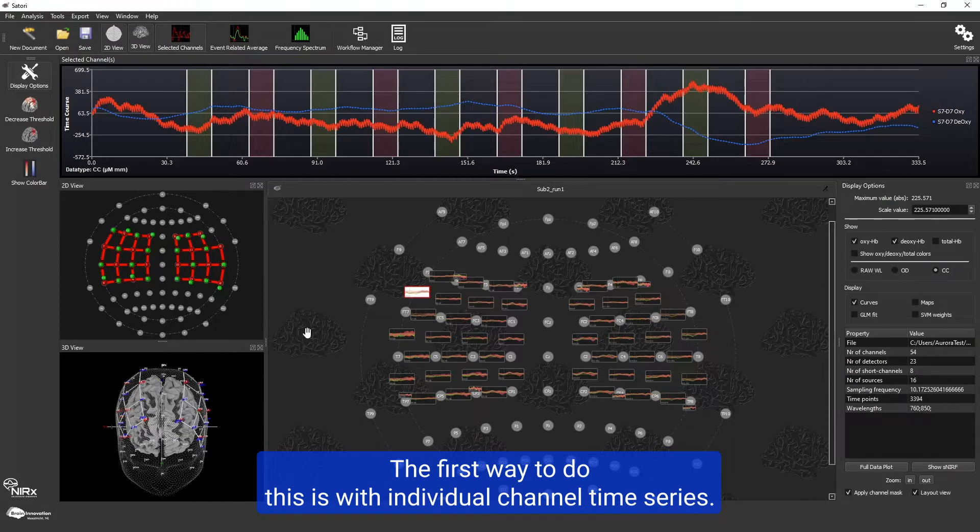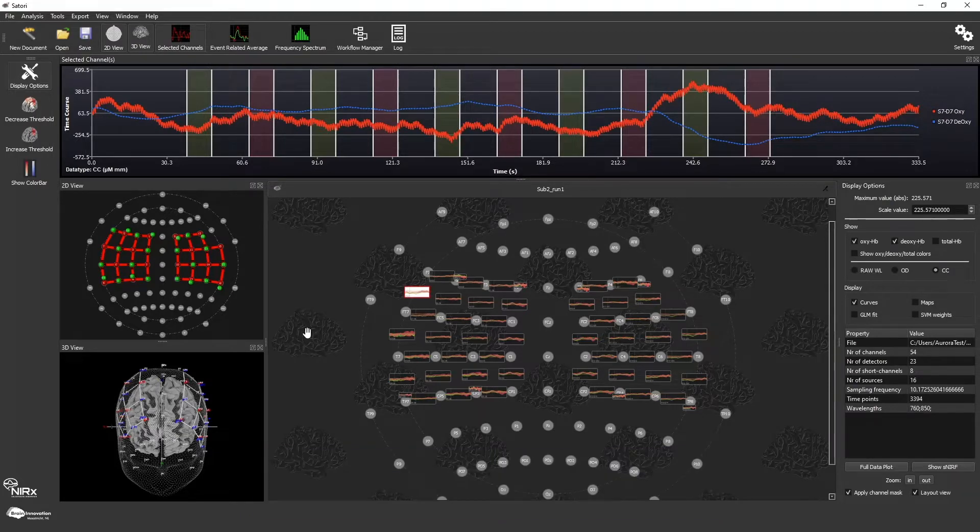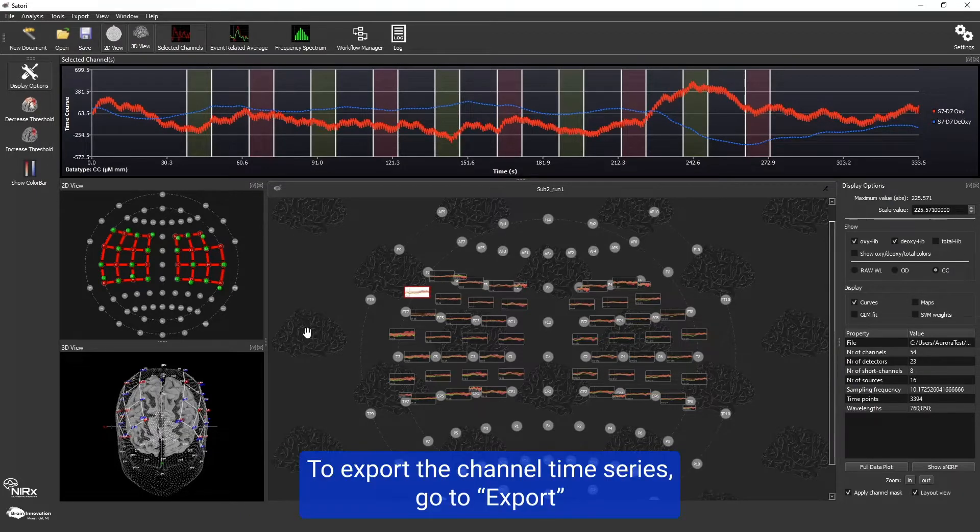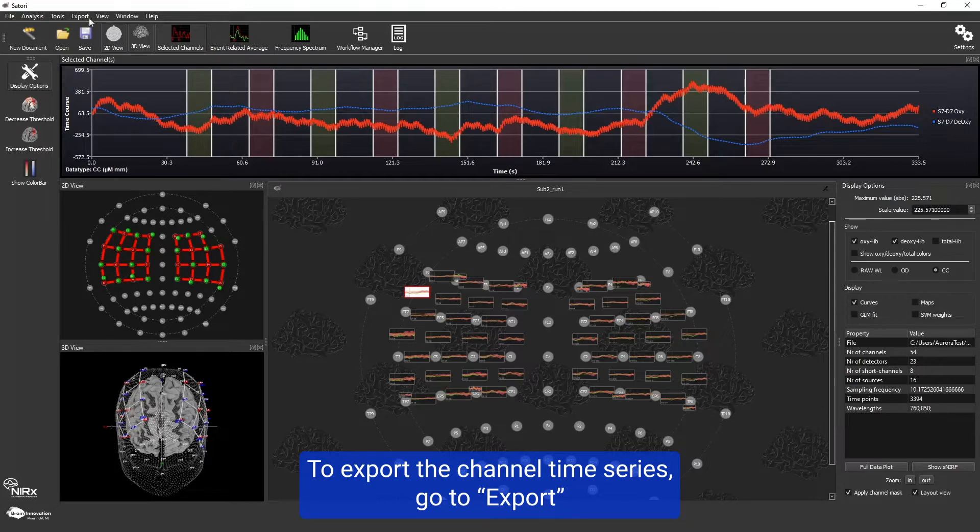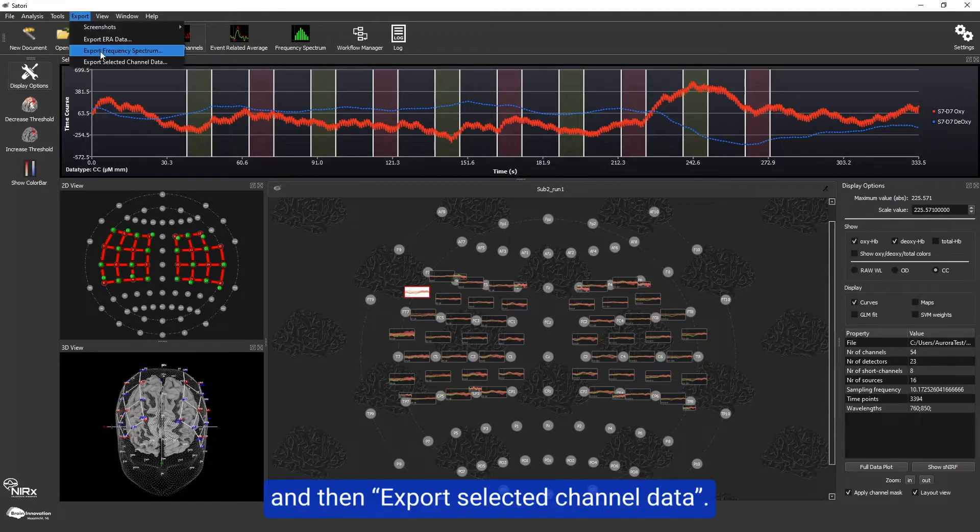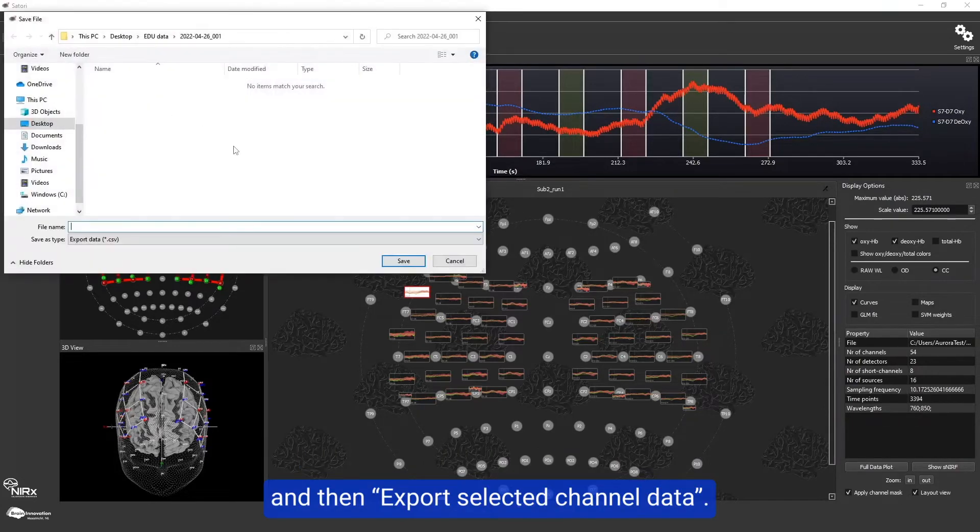The first way to do this is individual channel time series. To export the channel time series, go to export and then export selected channel data.